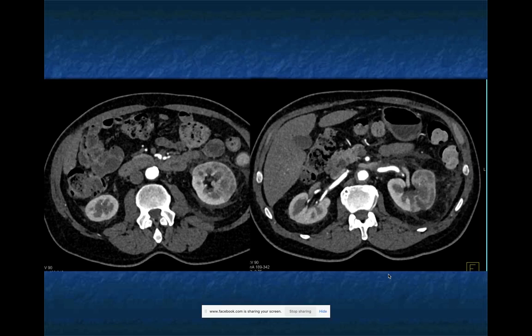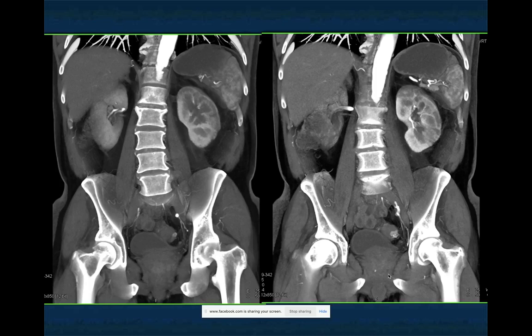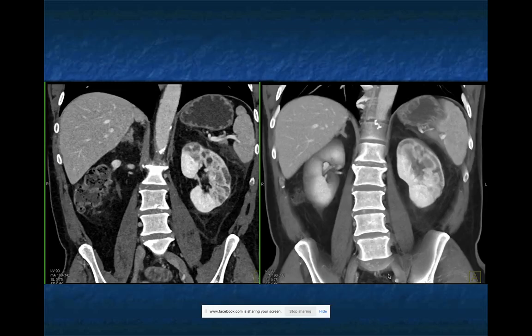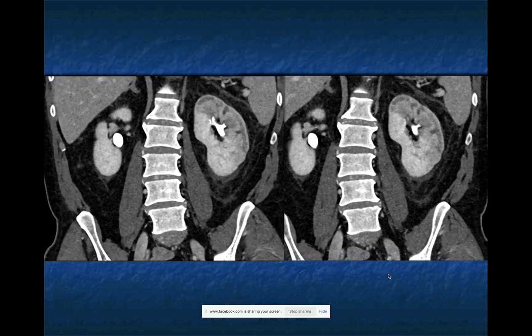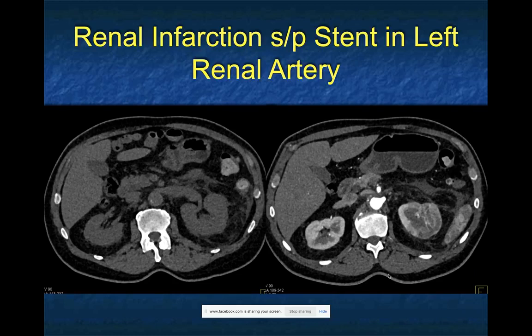It doesn't look like a tumor like a TCC. It involves about two-thirds of the kidney. Notice the irregularity of the cortical medullary interface on the 3D images, and here you can see it nicely in coronal as well. On the excretory phase imaging, the areas of decreased attenuation are nicely seen. The answer: the distribution and the changes in the cortical medullary interface are very characteristic of a renal infarct. The patient had a recent stent placed in the left renal artery. I always think about pyelonephritis, but the geographic changes - particularly the cortical medullary interface - point more to a vascular process.